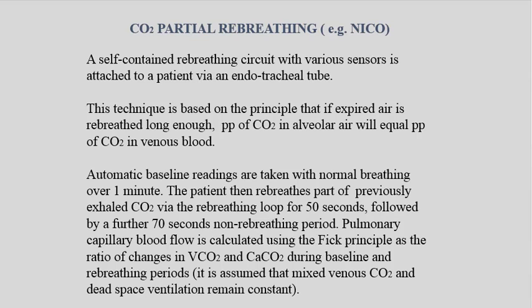use in intubated patients. The technique, and that's the important thing, is based on the principle that if you rebreathe your own exhaled air long enough, the partial pressure of carbon dioxide in alveolar air will equal the partial pressure of carbon dioxide in venous blood. Now that is a powerful little equilibrium point, and if you think about it, you'll understand why it is bound to happen. However, beyond a certain point, that equation or that balance will change for the worse for the patient.